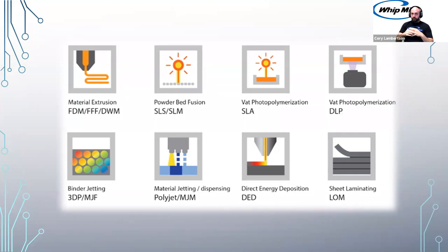From there, the next type you'll see inside of digital dental technology is stereolithography, vat polymerization, and also photopolymerization, DLP. We're going to see a couple of slides here that break it down even further, because this is actually what the VeriBUILD printer is. The VeriBUILD printer is a stereolithography printer. Now there are three types of stereolithography, and we're going to dive into what that is.